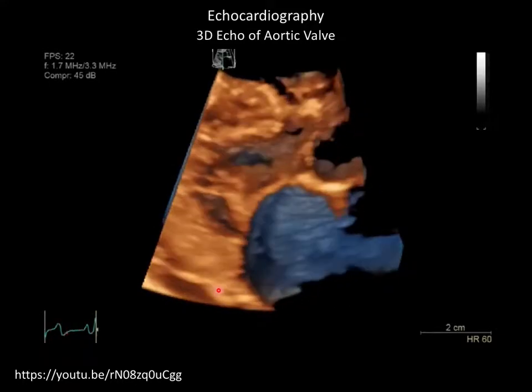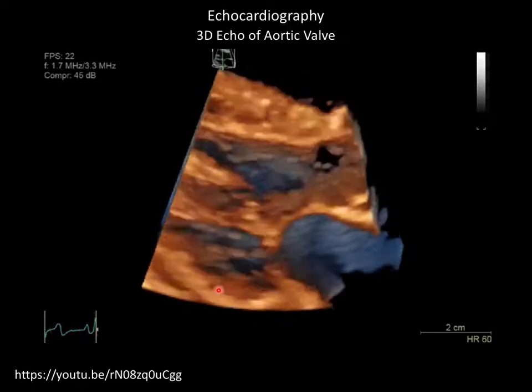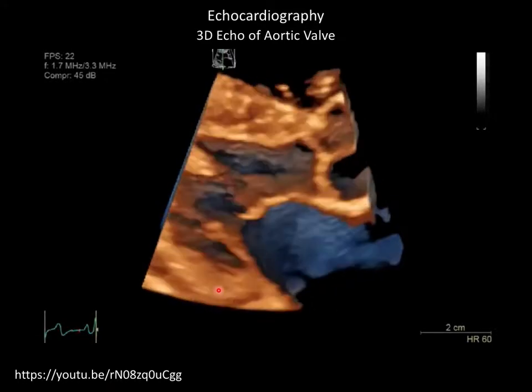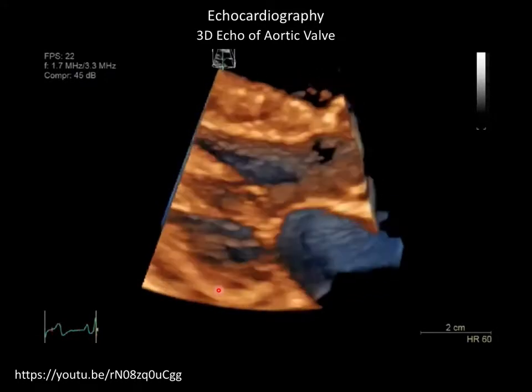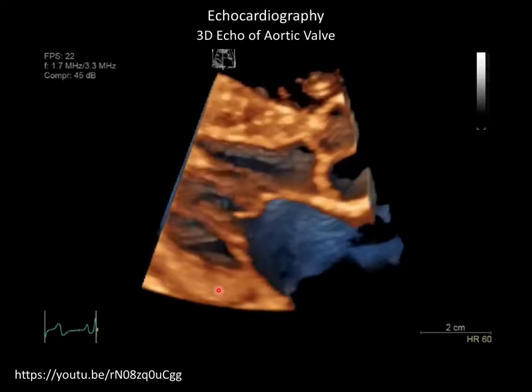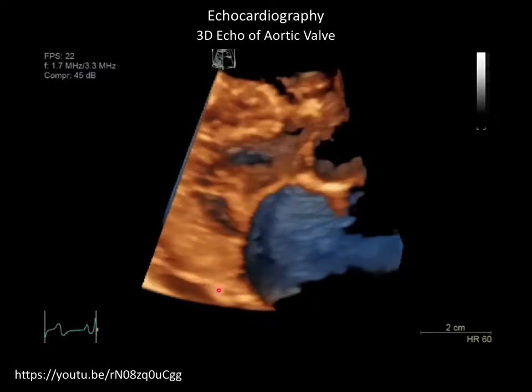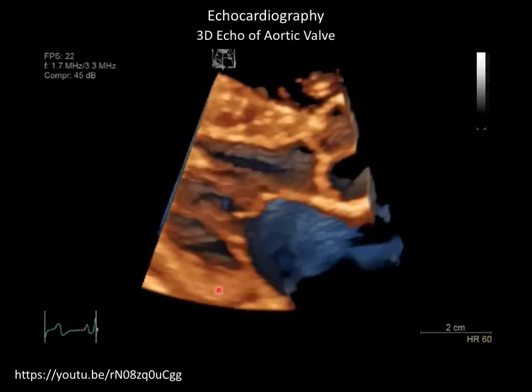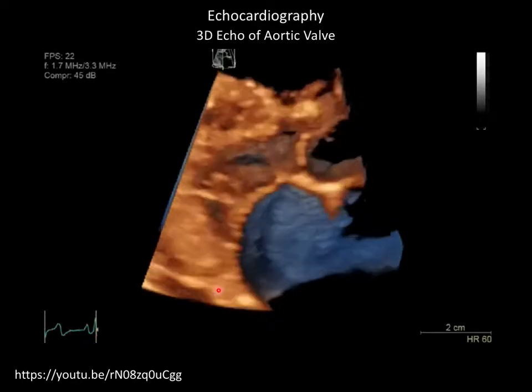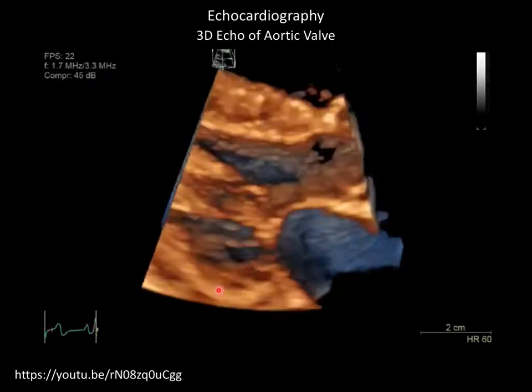My understanding is that the 3D is done 1 slice at a time. So you get a slice, move the whole thing, get another slice, move the whole thing, get another slice. But one could assume you could program the array to take your focal point and move it around in a two-dimensional trajectory that may be more efficient than, say, parallel slices, right?